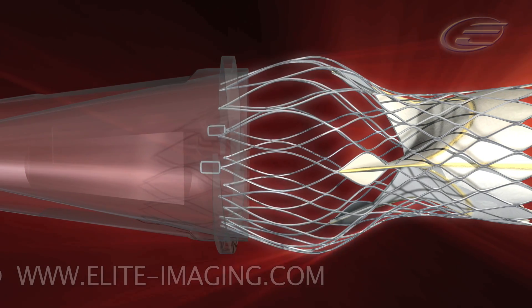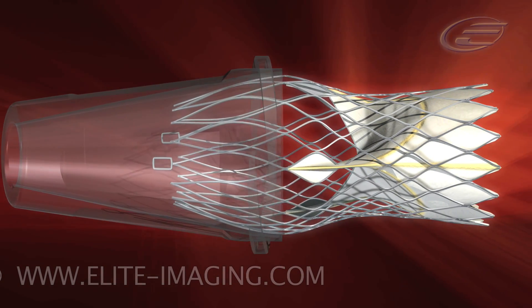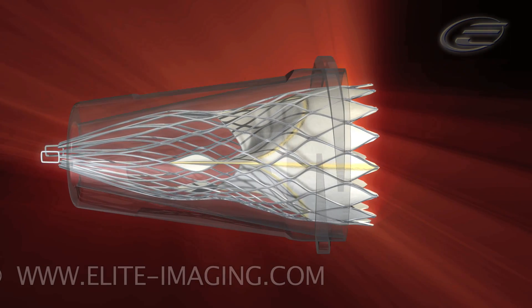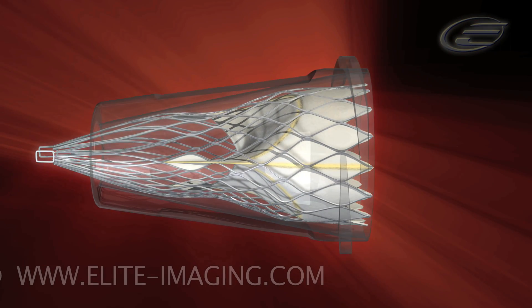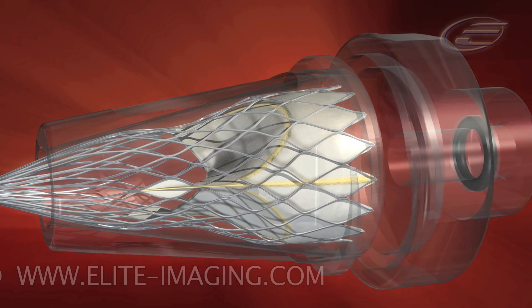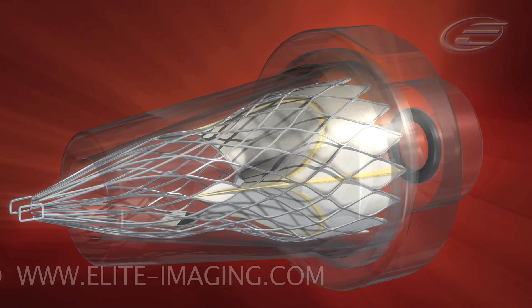Insert the outflow part of the frame into the outflow cone. Continue to slowly insert the frame into the outflow cone. Make sure that the frame is completely within the outflow cone. Secure the outflow cap to the outflow cone.